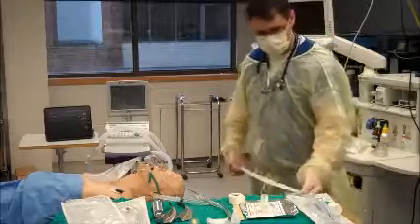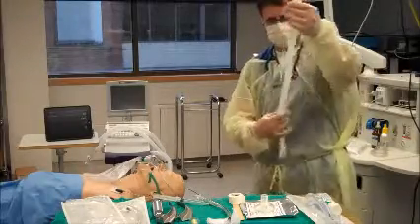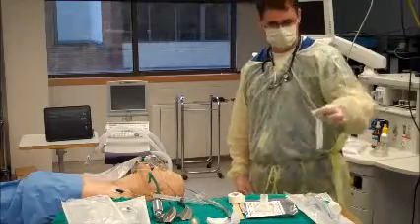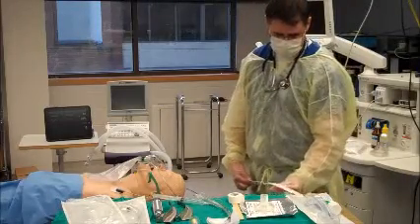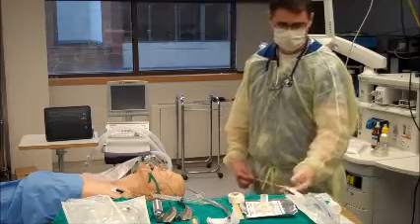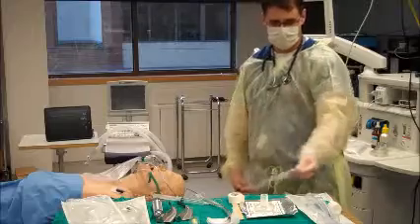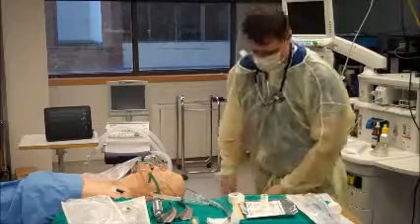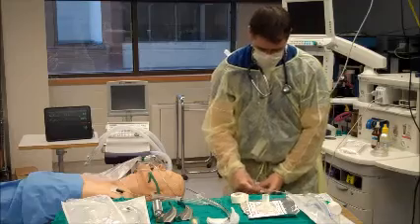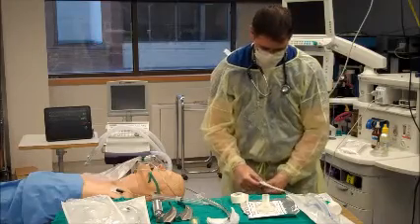Generally what I do is I make a long piece of tape that's going to go right around the patient's head, and a smaller piece that I'm going to use as backing. I put the backing closer to one side of the tape so that both adhesive sides stick together, and essentially the rest of it I wrap up into a tongue depressor so that it's easily accessible when I need it for securing.